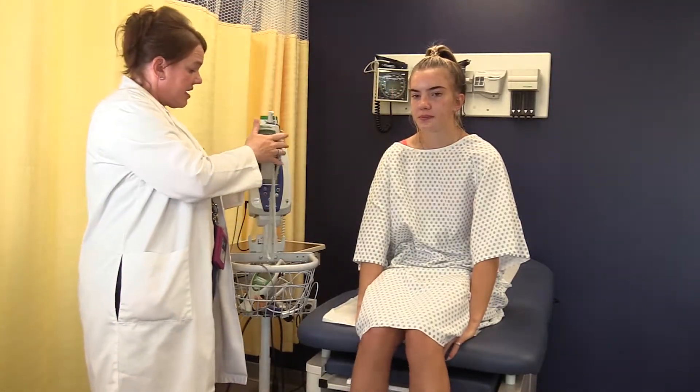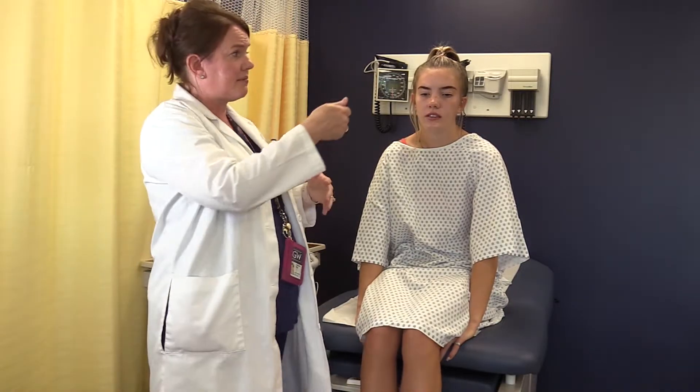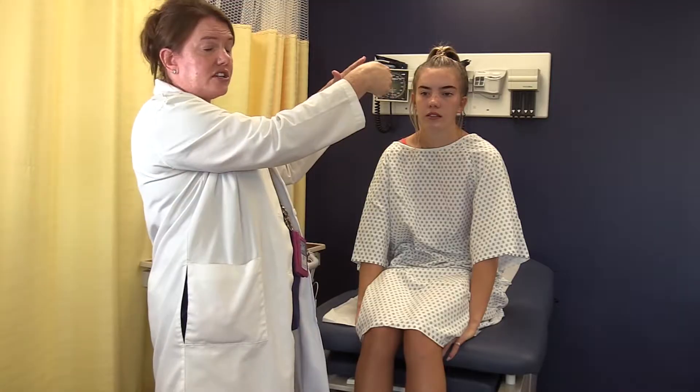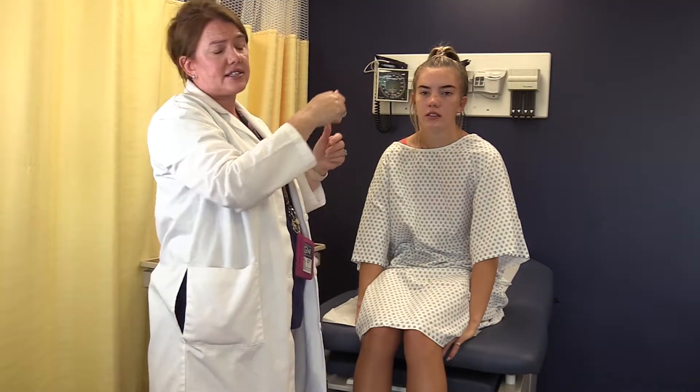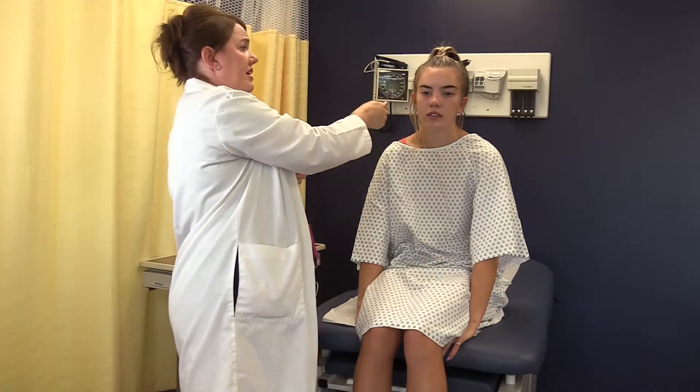Temporal is another route that we use, which is the forehead. There are a bunch of different types of temporal thermometers — some just scan without even touching the patient, others slide along the forehead, and some slide along the forehead, down in front of the ear and behind. You'll get familiar with which thermometer is used at the different facilities you're working at. Temporal is very common for post-ops and for pediatrics.